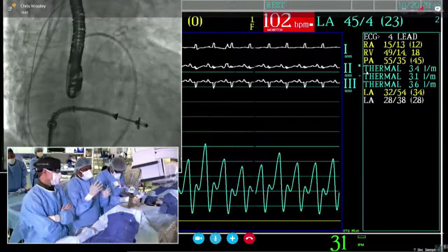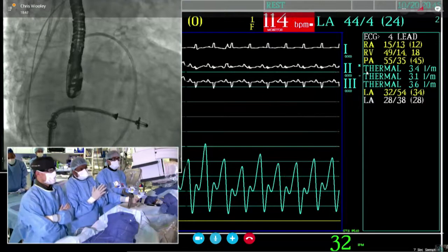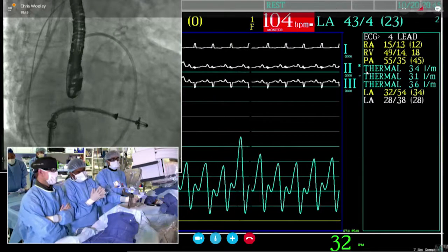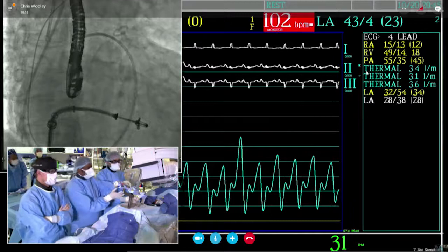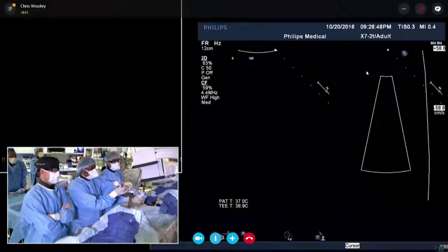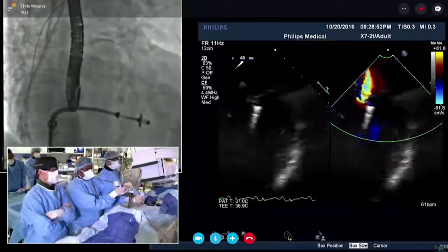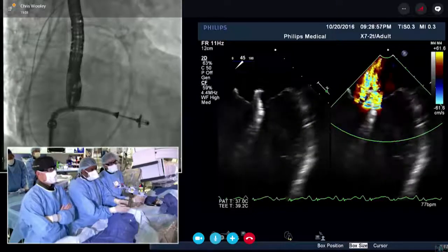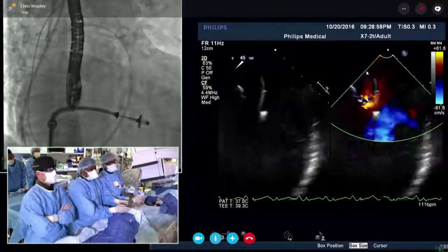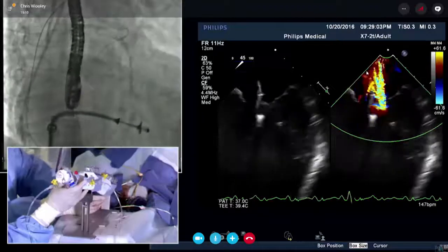Because it's a broad jet, we decided to go on the slightly medial aspect of the broad jet. The person who's doing it is Moody McCarr. Can I see where we are in the jet? Okay, so we're right in the middle of the jet. So we might just go a tiny bit more medial, to go a little past that.